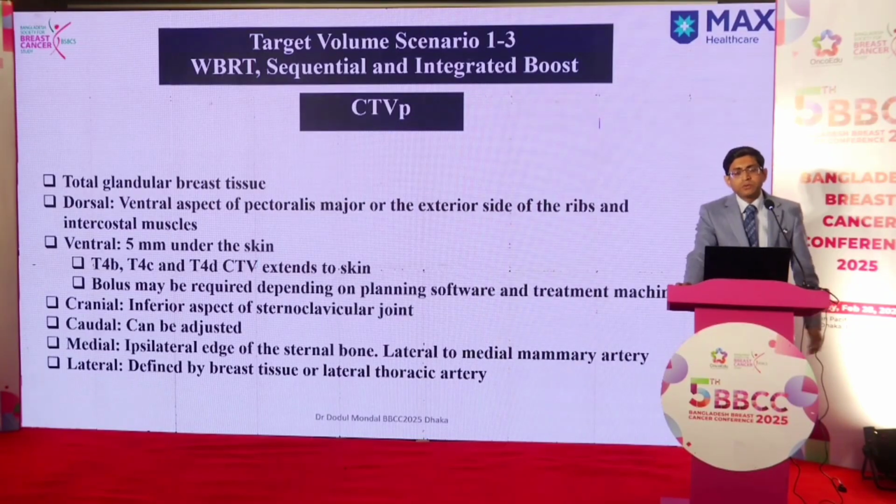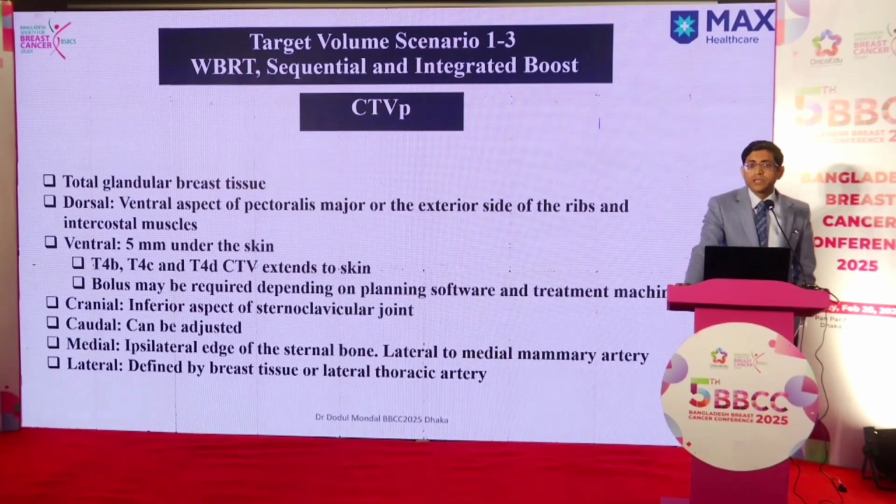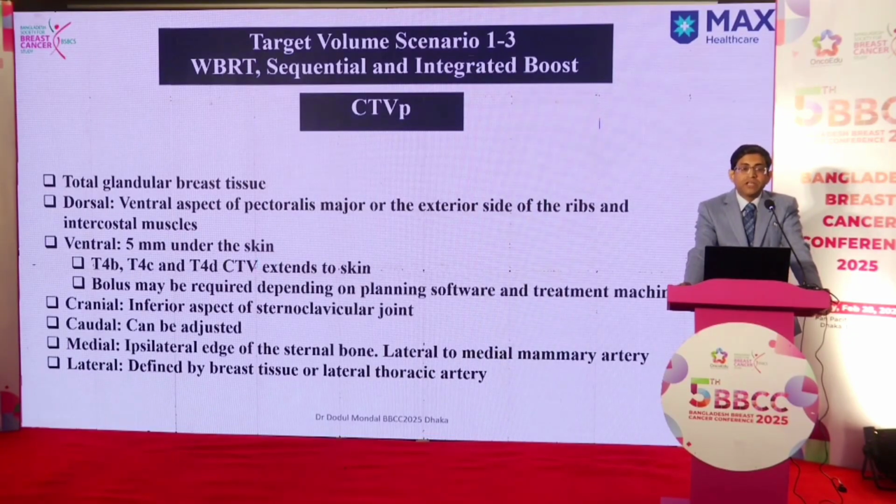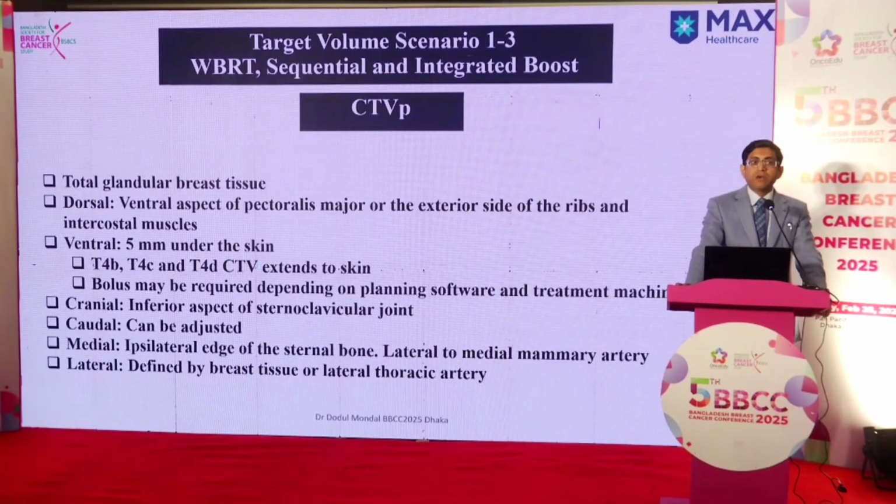And we are very proud to say that whenever we are in confusion, we always call our radiology colleague to show us and guide us for contouring. And it's also very important to have a dedicated breast radiologist who can also guide you for contouring the seroma or the cavity. Now, many times we contour the breast almost 4 months after the day of surgery, when the patient finishes adjuvant chemo. And then many patients come with different types of oncoplastic surgery. So it becomes difficult to identify the cavity or the preoperative breast tissue. So a radiologist will definitely be of great help in this situation.